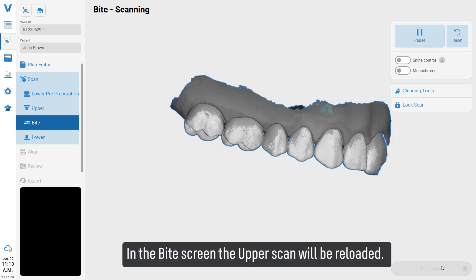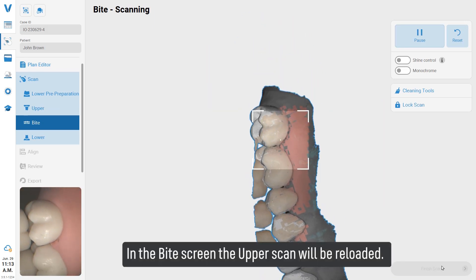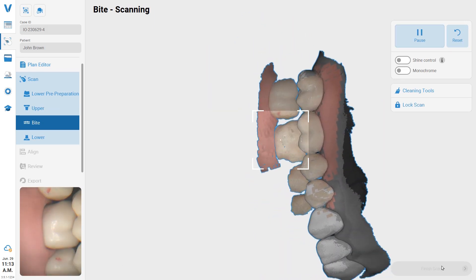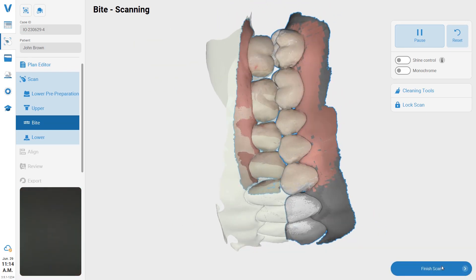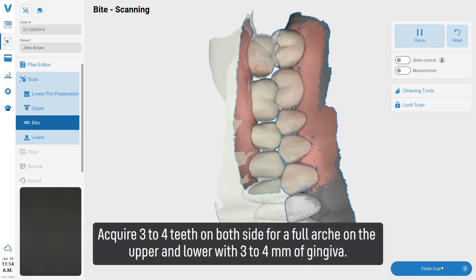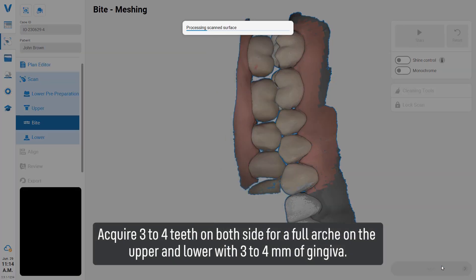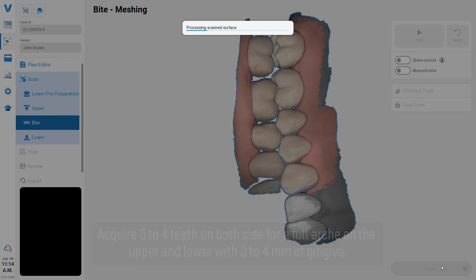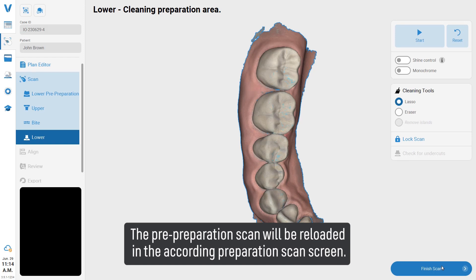In the bite screen, the upper scan will be reloaded. Reconnect the handpiece on the upper molars and acquire three to four teeth on both sides. For a full arch on the upper and lower, the pre-preparation scan will be reloaded.